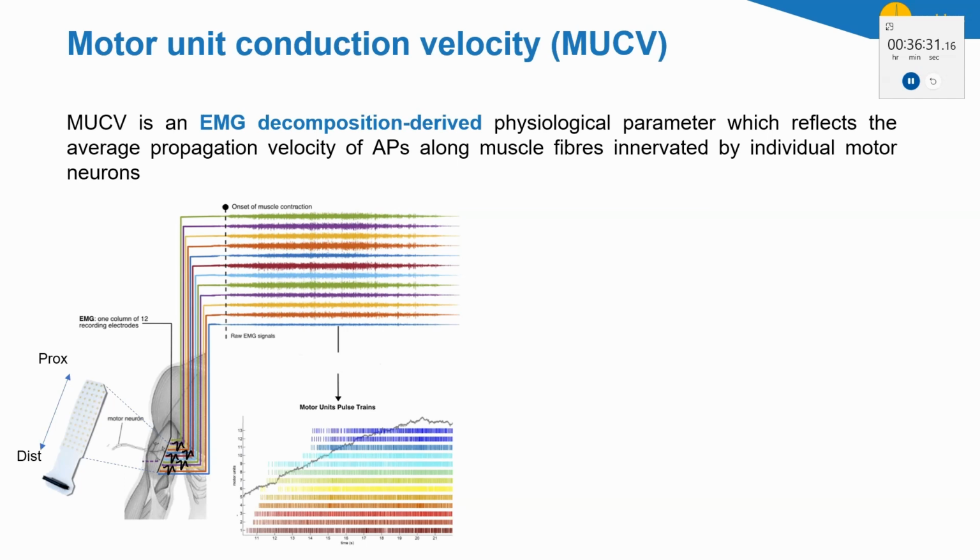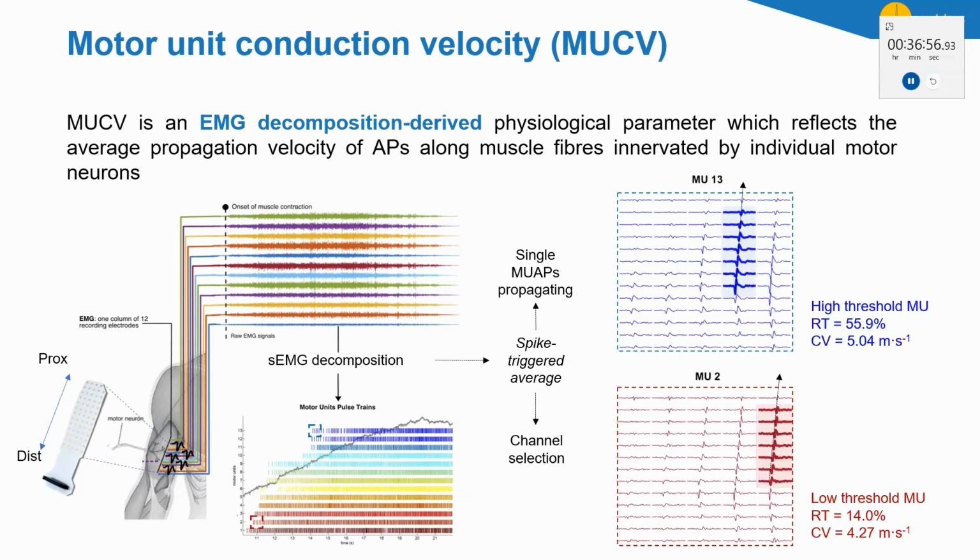We record the HDsEMG signals, and then we apply an algebraic procedure that we all know, which is surface EMG decomposition. This is done to obtain individual motor unit pulse trains, and then with an additional algebraic procedure, which we'll see in a second, but I guess most of you are already familiar with, the spike triggered averaging, we are able to identify and to study the contribution, and in this case, the peripheral properties of individual motor units, rather than average values of several concurrently active motor units.